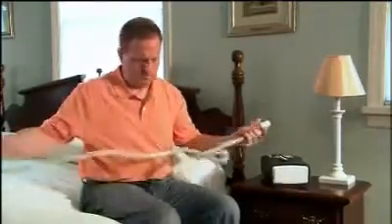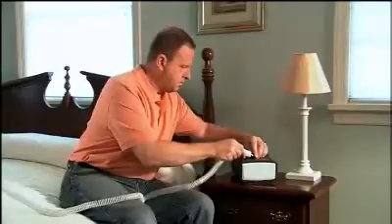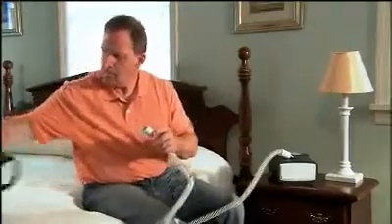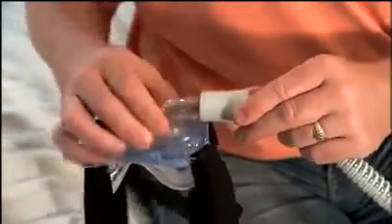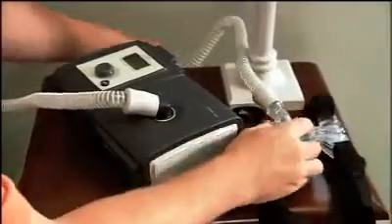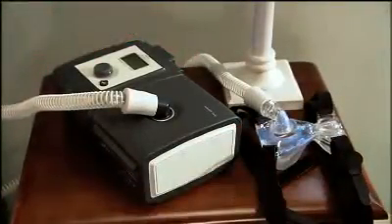Now attach the flexible tubing to the air outlet port on top of the humidifier, working the tubing into place until you have a good, secure fit. Connect the other end of the tubing to a mask and headgear. Refer to the instructions that came with your mask for tips on how to get a good, comfortable fit. System One is now complete. For instructions on how to operate your device, watch the operations segment of this program.